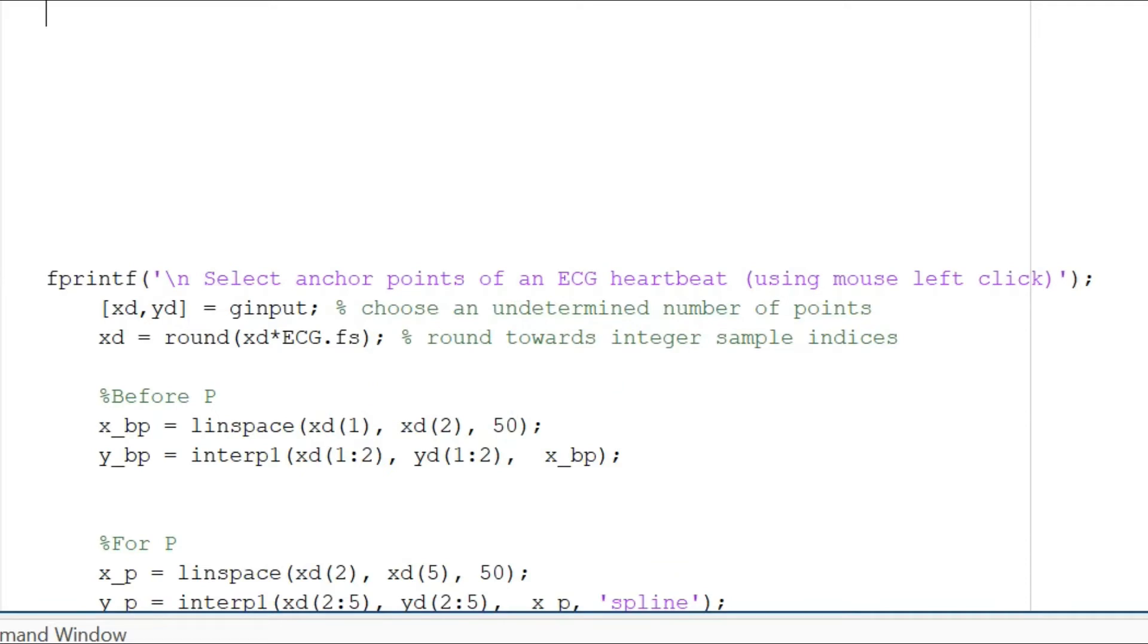We do not set the number of points that we want. We will just keep on choosing infinite number of points. Of course we will not actually do that, but this particular line indicates that you can choose infinite number of points.